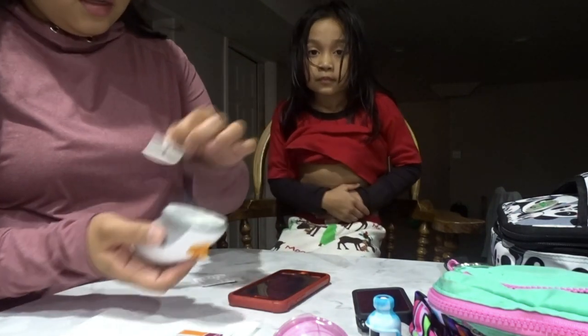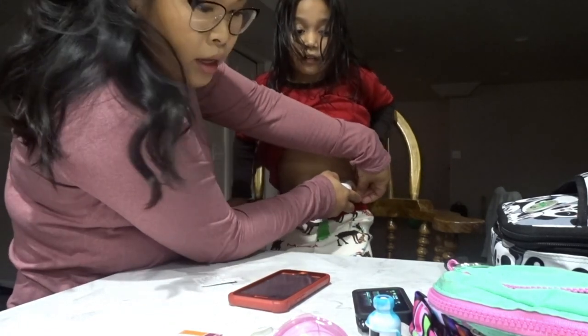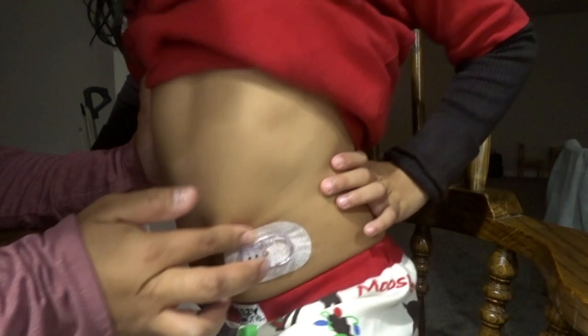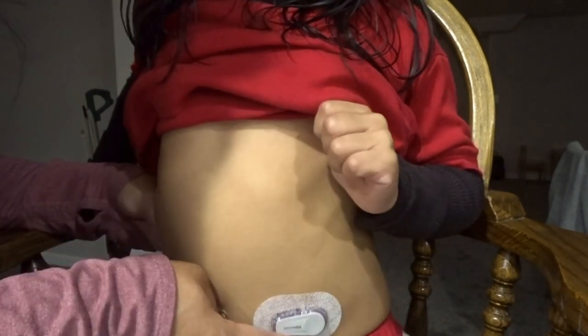We're going to peel off and take off the orange piece. We're going to count - one, two, three! Make sure you rub it really, really well - let's rub it three times all around. Then we're going to take the transmitter - this lip right here goes right into the little slot - and make sure it clicks twice. One, two - there are those two clicks. Make sure it's really flush to the sensor.